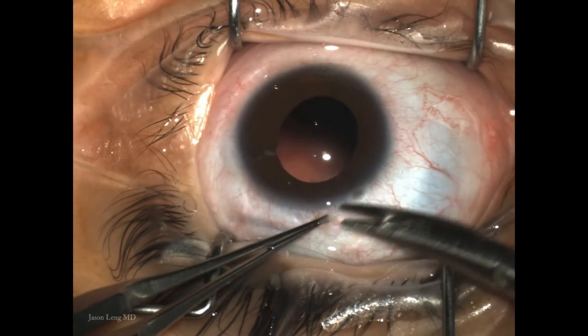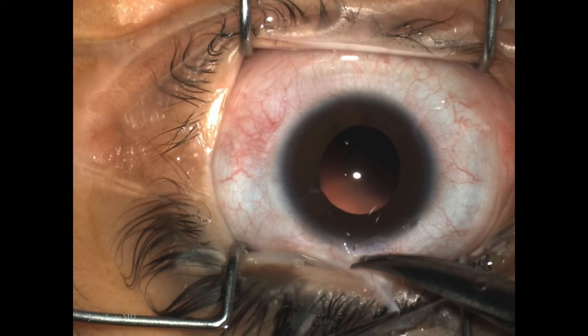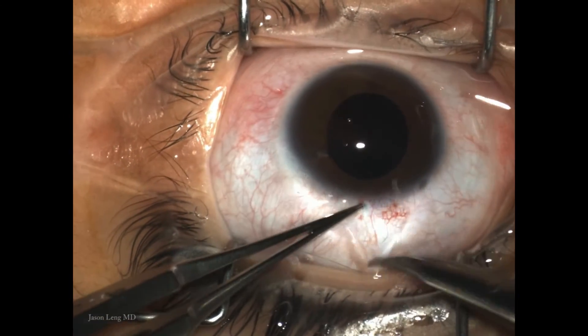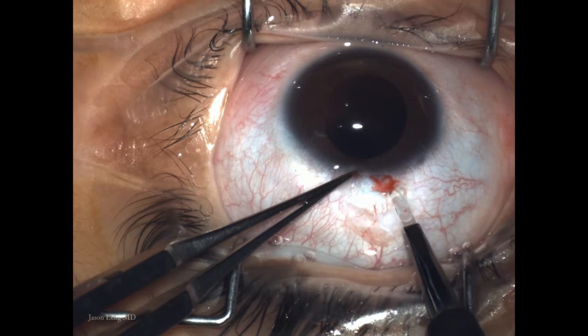This case is a secondary IOL placement using trans-conjunctival intrascleral fixation described by Yamane from Japan at the 2016 ASCRS meeting.